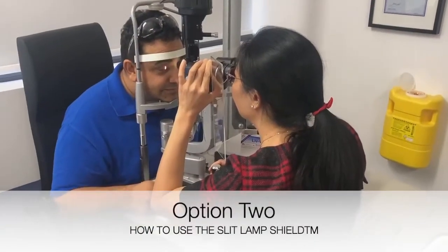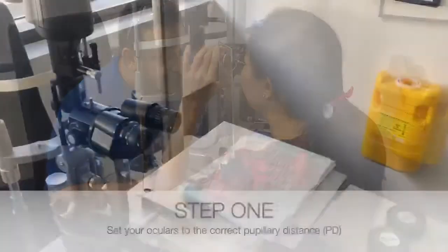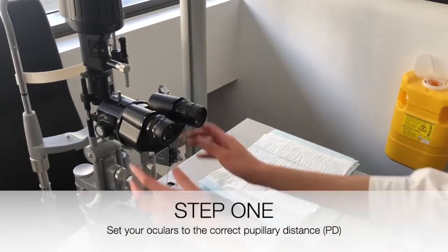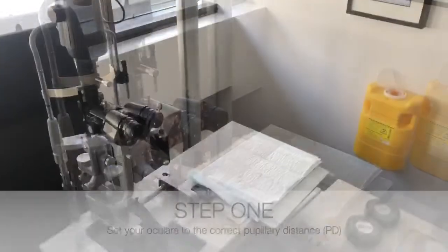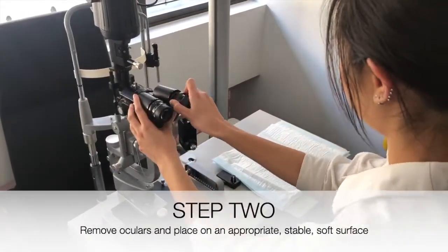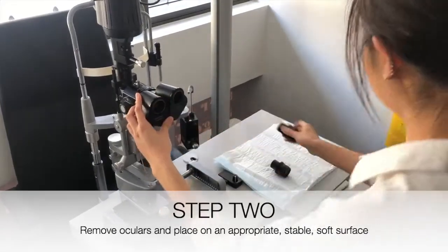Option 2 allows you to secure your slit lamp shield in place using your oculars. Step 1: Set your slit lamp oculars to the correct pupillary distance. Step 2: Remove your slit lamp oculars and place them carefully sideways on an appropriate, stable, soft surface.